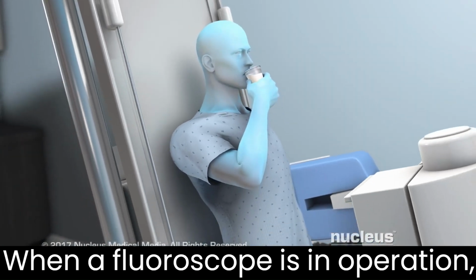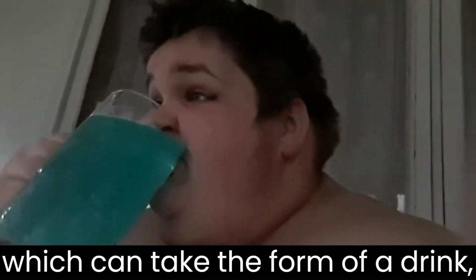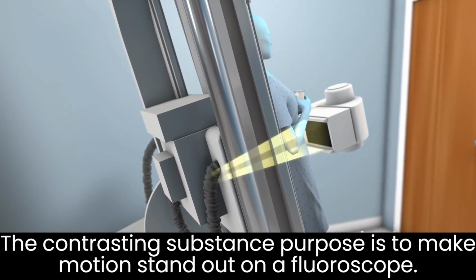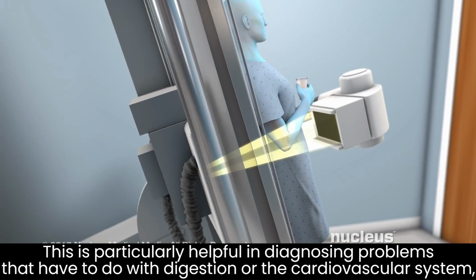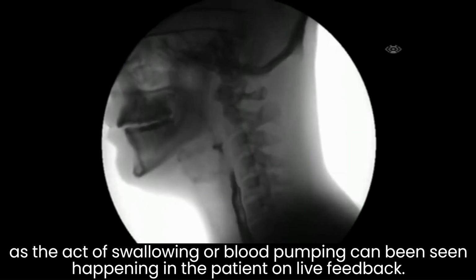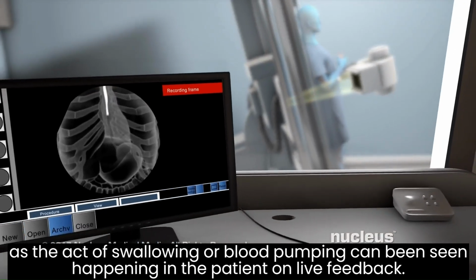When a fluoroscope is in operation, the patient will be given a contrasting substance, which can take the form of a drink, pill, injection, or paste. The contrasting substance's purpose is to make motion stand out on a fluoroscope. This is particularly helpful in diagnosing problems that have to do with digestion or the cardiovascular system, as the act of swallowing or blood pumping can be seen happening in the patient on live feedback.